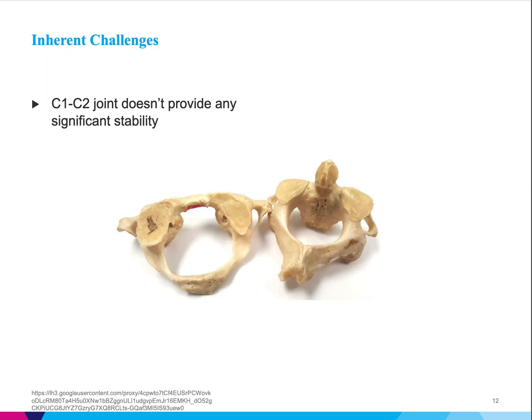Well, if C1-C2 is so important, one question that might arise is, why don't we already have an arthroplasty? Why wasn't that the first area investigated for development of an arthroplasty? The answer, suffice it to say, is that it's challenging. Remember, when we look at the C1-C2 articulating surfaces, they're mostly flat. This allows translation anteriorly, posteriorly, and even side-to-side. And joints can also be stabilized by joint capsules that help to reinvest and support the integrity of the joint.